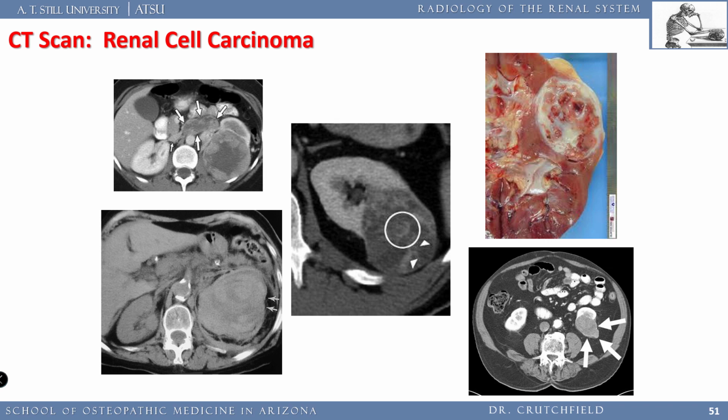But you got to make sure your patient's creatinine is normal. The serum creatinine's got to be normal, or they're not going to do your IVP because the iodine dye that they inject intravenously can kill the kidney. So you got to be aware of that.